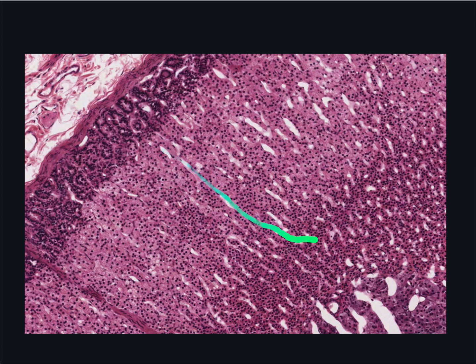The parenchymal cells form columns, one or two cells wide, between these capillaries. As the blood leaves the zona reticularis, it enters the sinusoids of the medulla and also bathes these cells. So hormone secretions from the adrenal cortex can have an almost immediate effect on endocrine cells in the adrenal medulla.